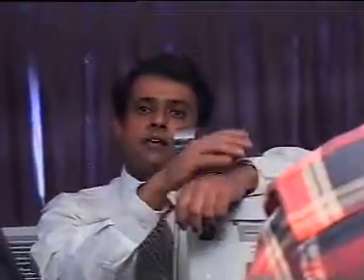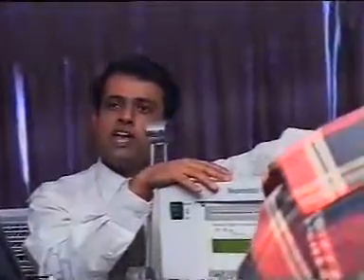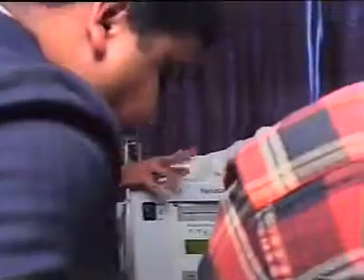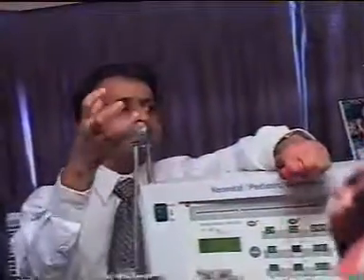Another thing, FiO2 has no effect over carbon dioxide, obviously. Come to the next setting, PIP. What does the PIP do to the PaO2 or oxygen level? Increases. And what does it do to the carbon dioxide? PIP? No, it does. What is PIP?